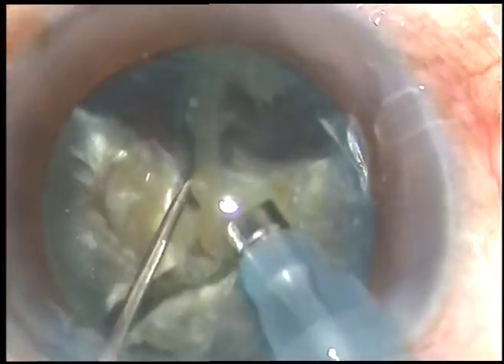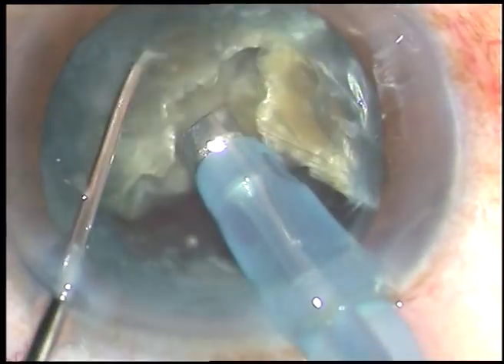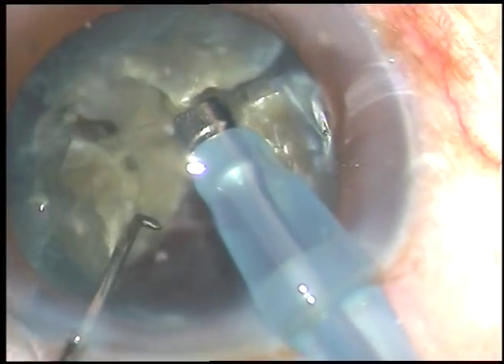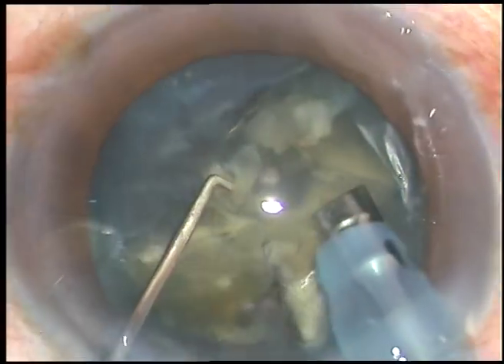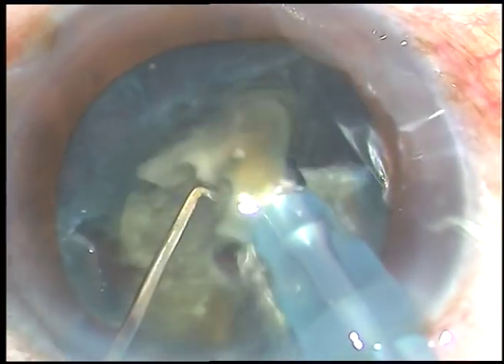FECO power used in this case is 80%, flow rate is 45 ml per minute, and vacuum is 450 mmHg. Here the two fragments are not separated, so attack from the apex and immediately the two fragments get separated from each other.